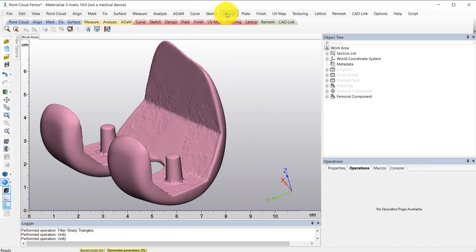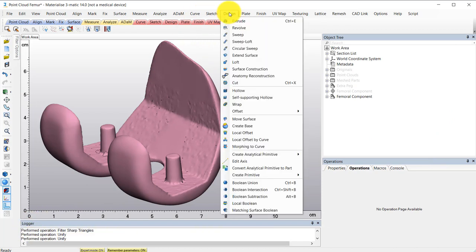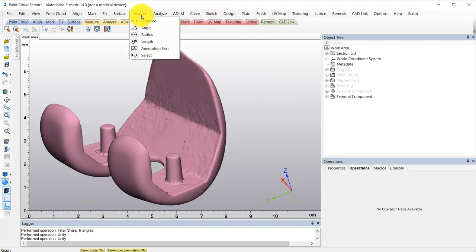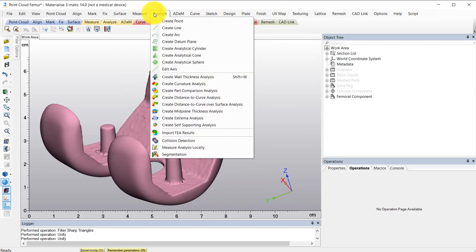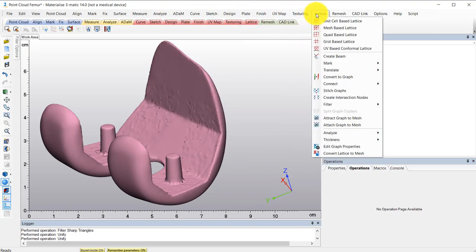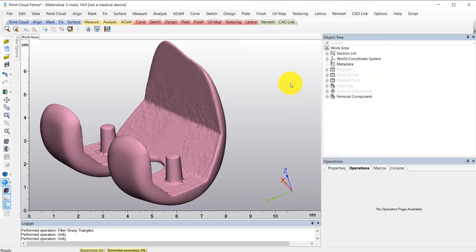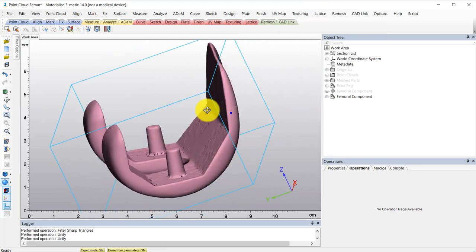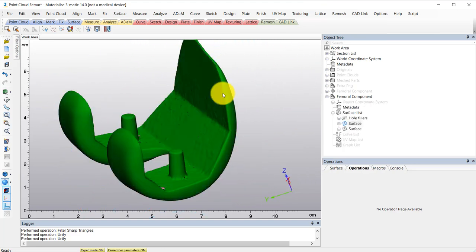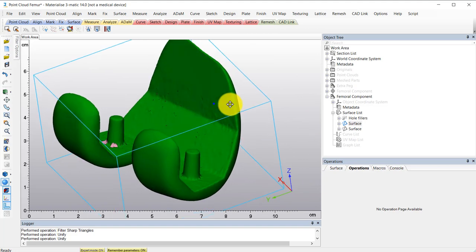Now we're ready to manipulate or analyze this further however way we'd like. So let's say for this example, I decided that we actually need a third peg for this device to really sit well on the femur. However, right now this is all for the most part one surface.